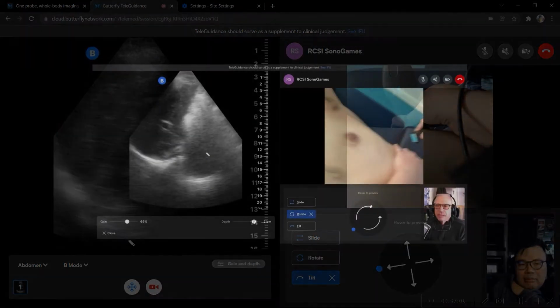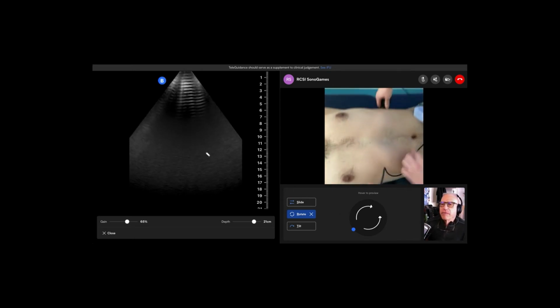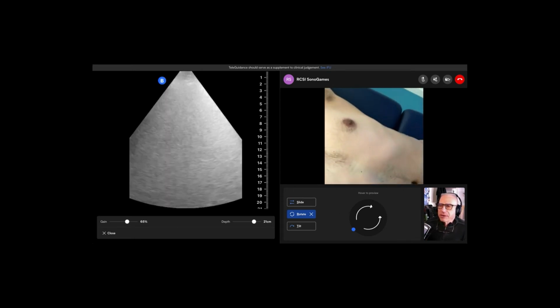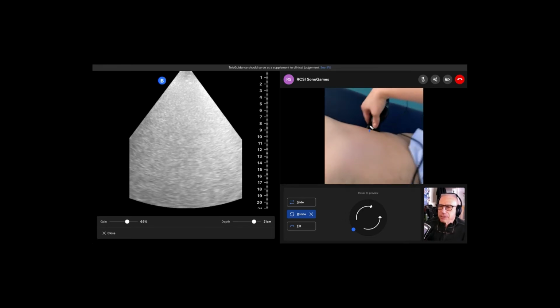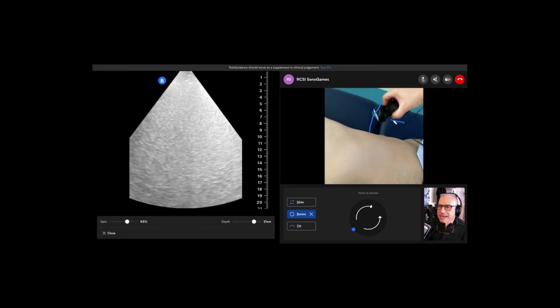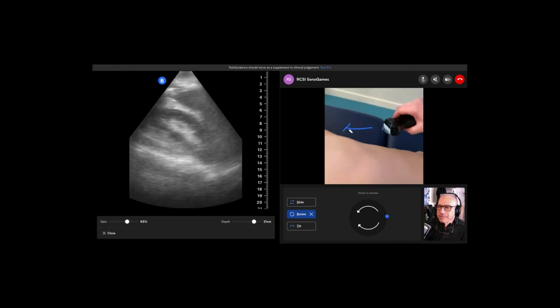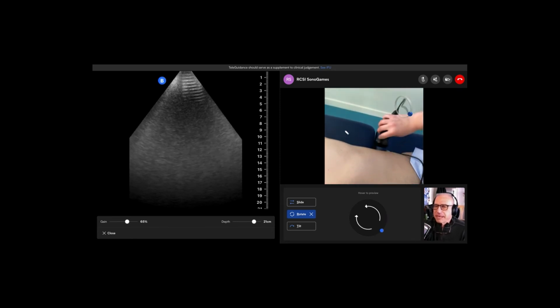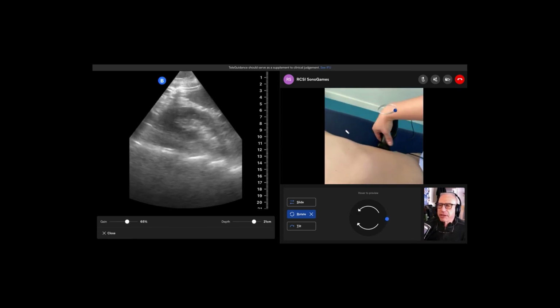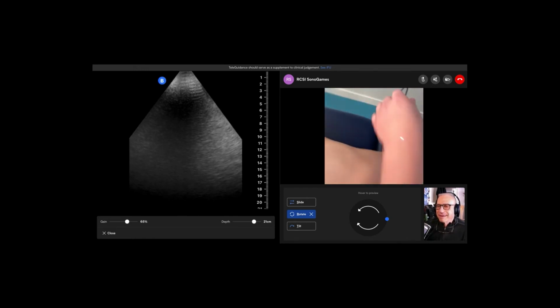Good job, Dilal. Okay. Now for the left side, my bias would be to take your hand and flip it over, and get your fingers on the bottom and the thumb on top from the other side. Flip it upside down, so your hand is underneath, coming from this side over here. Yeah. Okay. There you go.